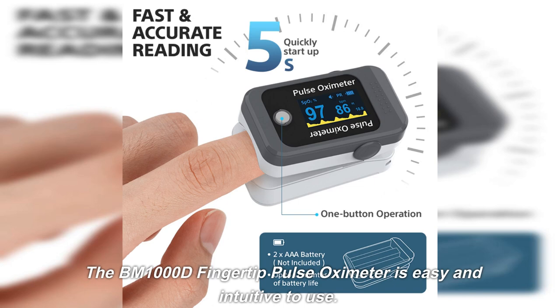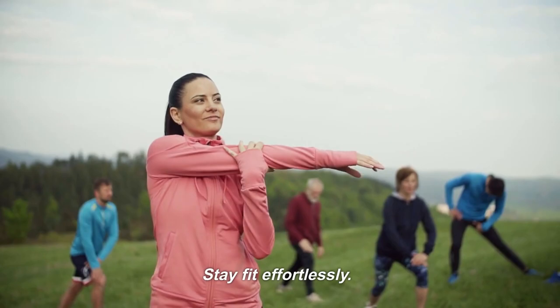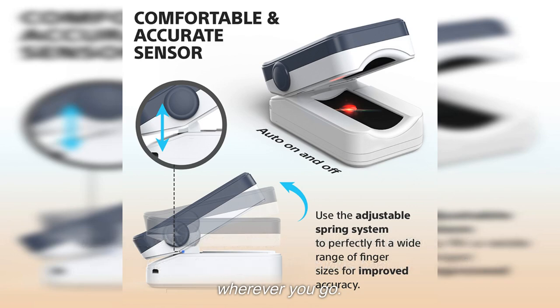The BM1000D fingertip pulse oximeter is easy and intuitive to use. Simply place your fingertip on the device and it provides accurate, real-time measurements of blood oxygen saturation, pulse rate, perfusion index and respiratory rate. Stay fit effortlessly. The product is designed for convenience. Its compact size makes it easy to carry for continuous health monitoring wherever you go.